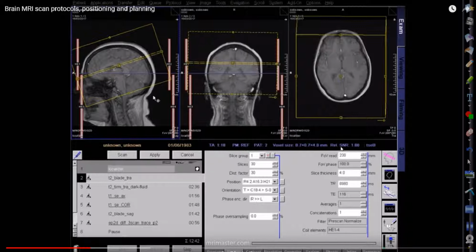SNR. What does SNR stand for up here? Signal to noise. You want to keep this number around 1, because 1 means basically 100% signal. Okay? So as you adjust these things, you'll take a look and go, ooh, I can reduce the amount of time, but ooh, look what it's doing to my signal. So always, after you mess with a parameter, look up here. And the other thing you want to look at when you mess with your parameters is over here.